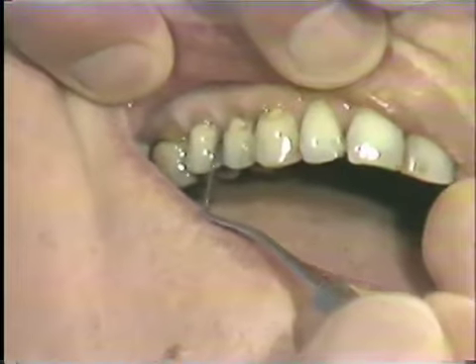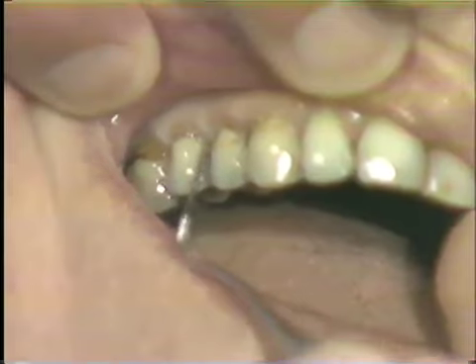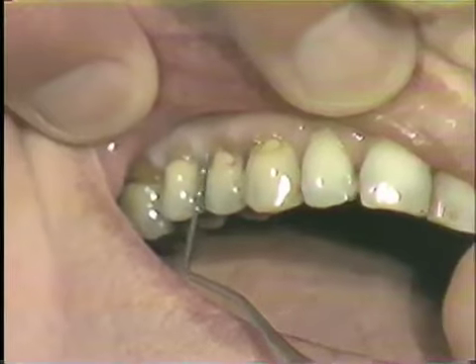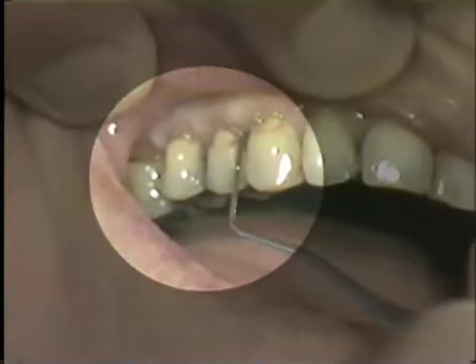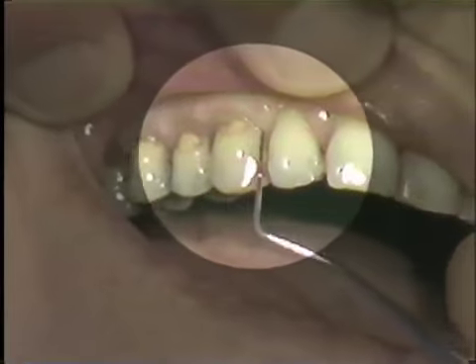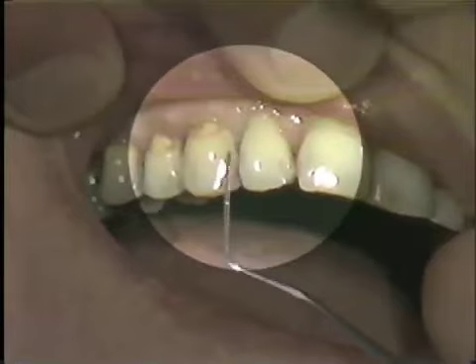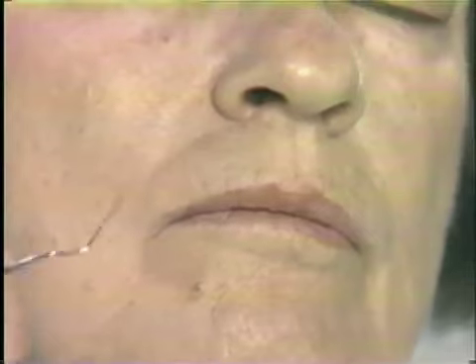Now, in this procedure, the interproximal areas are measured both buccally and lingually, and the buccal and lingual areas are measured as well. It's possible to move around the entire tooth without removing the probe entirely from the gingival sulcus. I think that you can see that the tip of the probe is entering the gingival sulcus to a depth of about 3 millimeters.